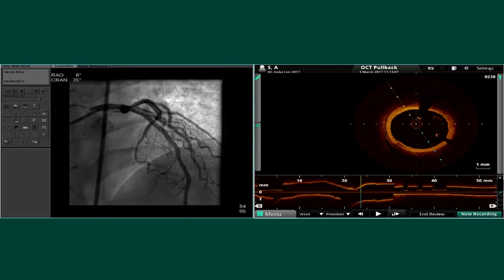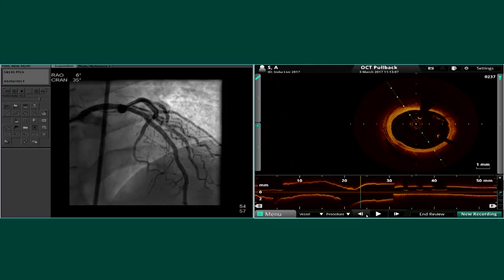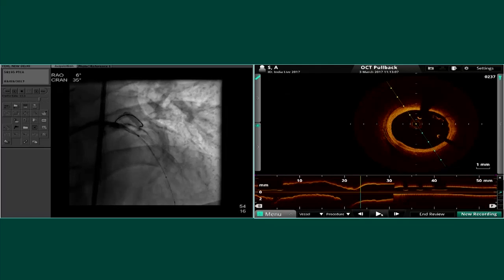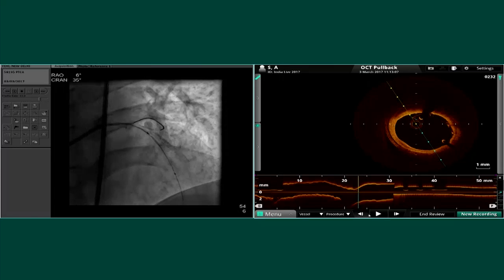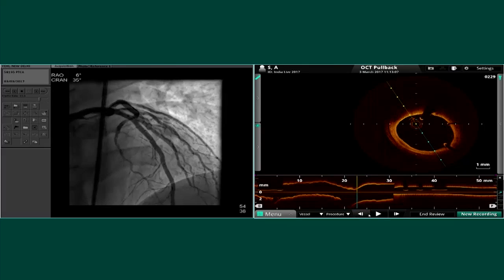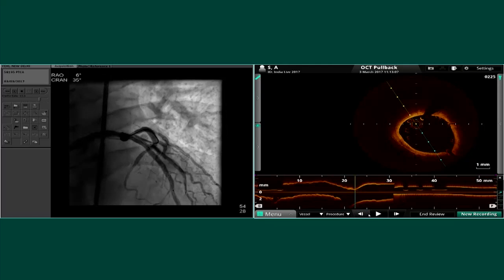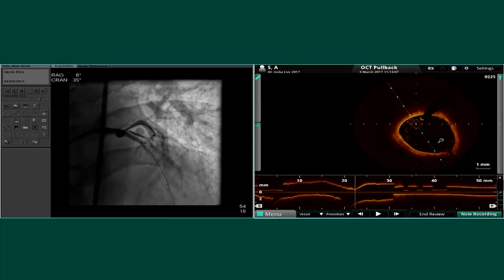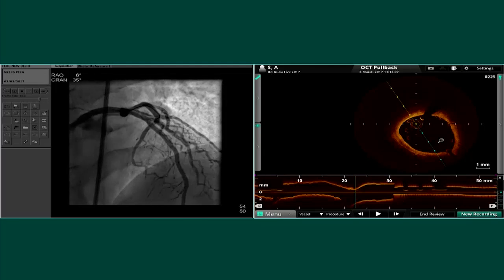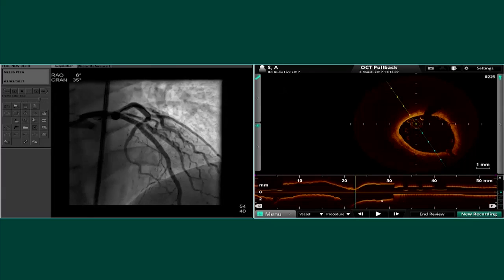Just two steps forward. Just go. Yeah, that's right. And go towards circumflex. Stop. Go more towards circumflex. More towards circumflex. And you start seeing the circumflex here. By the way, this is circumflex. You see that? This is where it's the circumflex. One millimeter more towards circumflex.